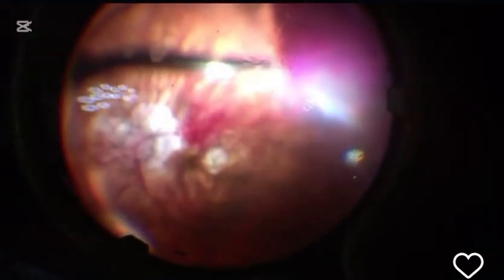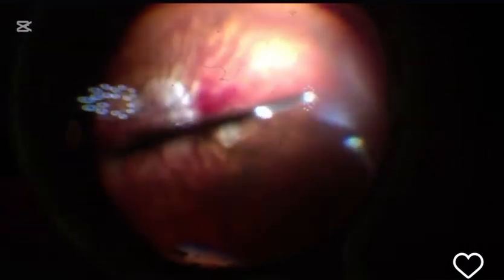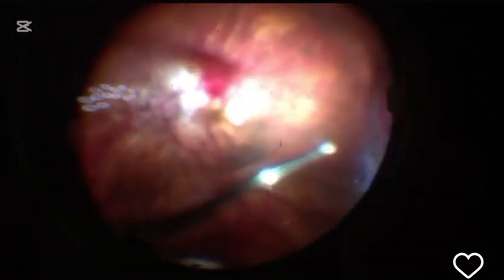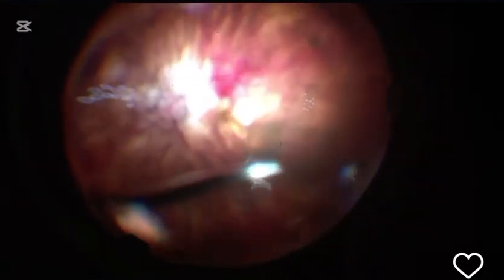Continue shaving. Swap your hands. Luckily, this is a pseudophakic eye, so it's well known that crossing hands is forbidden in a phakic eye. But it's much easier to swap your hands half and half, to continue all around shaving.